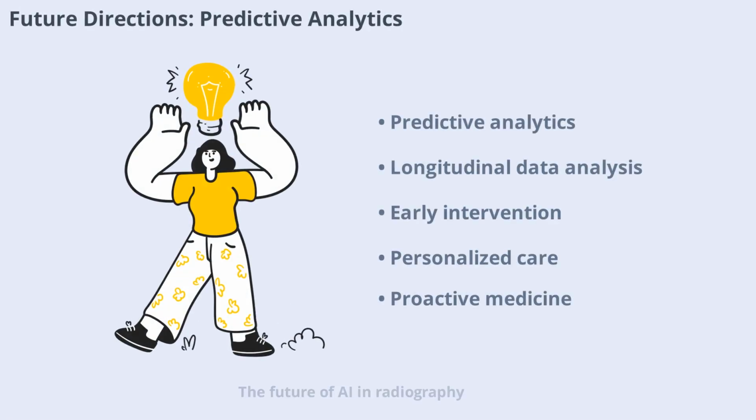The future of AI in radiography moves toward predictive and preventive analytics. AI models will analyze longitudinal imaging data to identify markers of disease progression before symptoms appear. This shift enables early intervention and personalized care, transforming diagnostic imaging from reactive to proactive medicine.